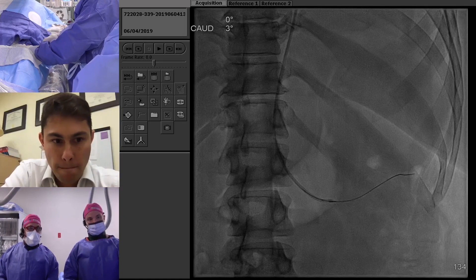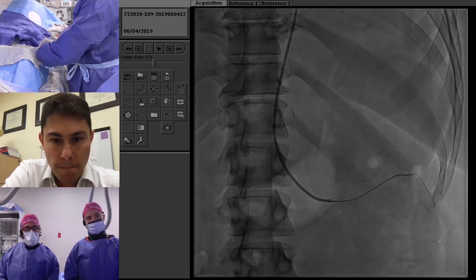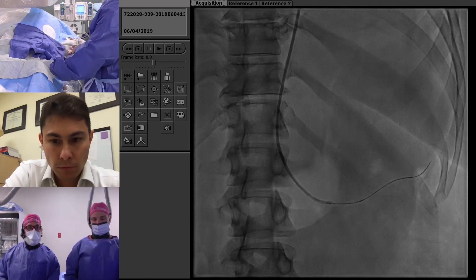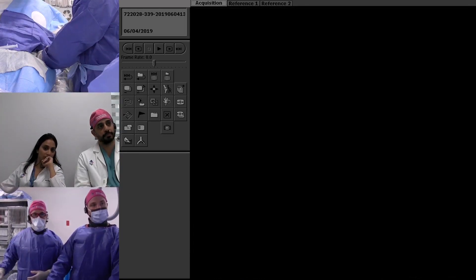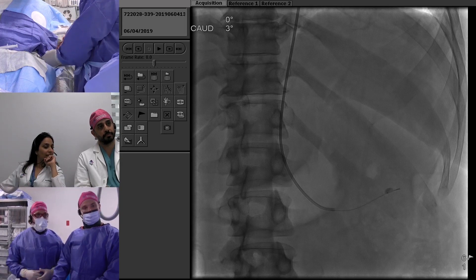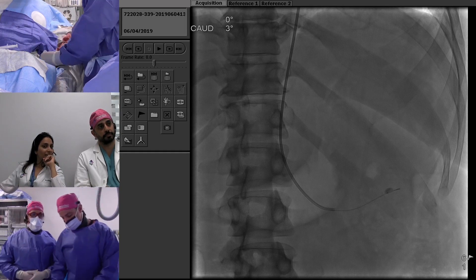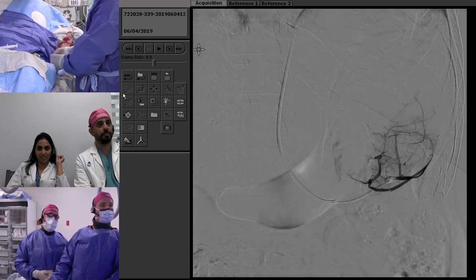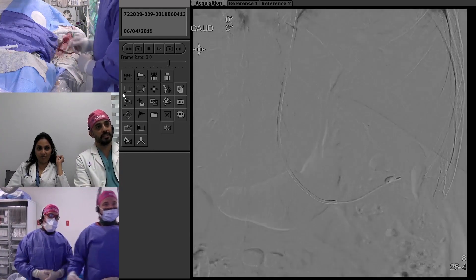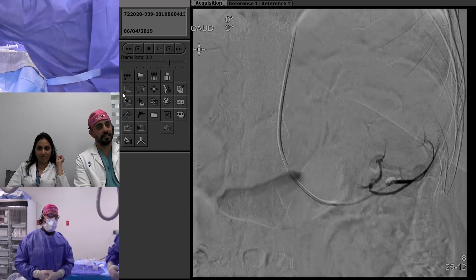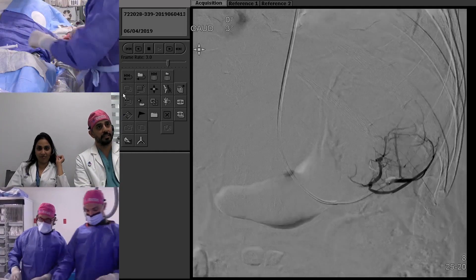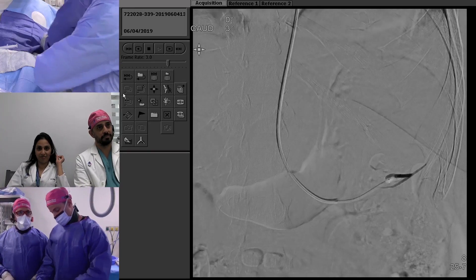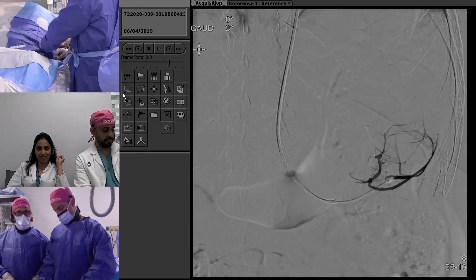We're taking a picture just outside this vessel to get a sense of where we are. We're going to inflate the balloon and see if we can get a better sense of flow. The flow looks a lot different than what it looked like initially — probably the multiple feeders coming around. We might have to pull back a bit into the main trunk; we're too distal. Let's take the balloon down and pull it back. I want to deliver the embolic from a spot where we can cover almost the entire vessel with this one microcatheter if we can.